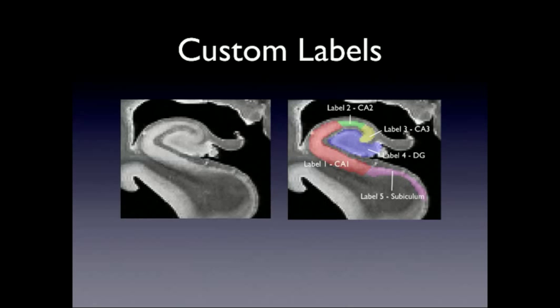So that's why we have support for custom labels. You can make a file that stores the names of these things and then load that up as part of initializing ITK-SNAP. So you load the grayscale image, then you load the segmentation and the label file, and it ensures that you're working with the same labels for the same structures.